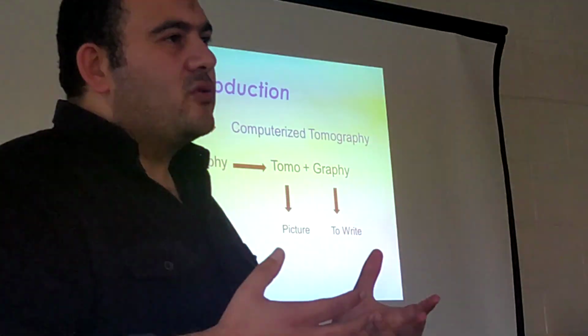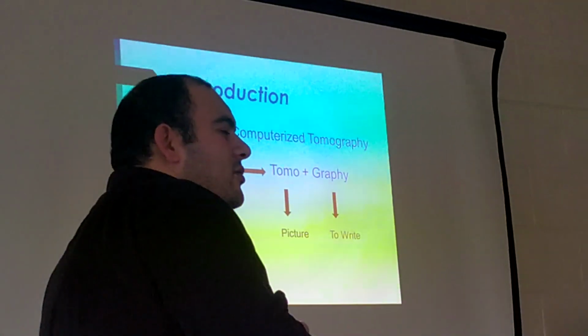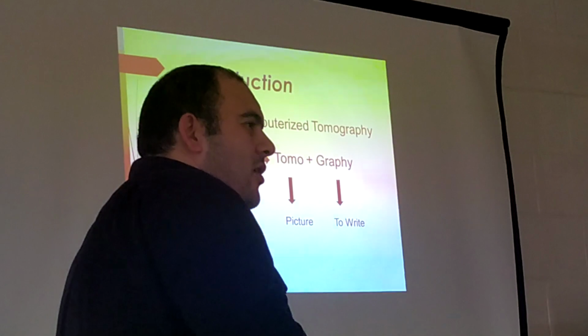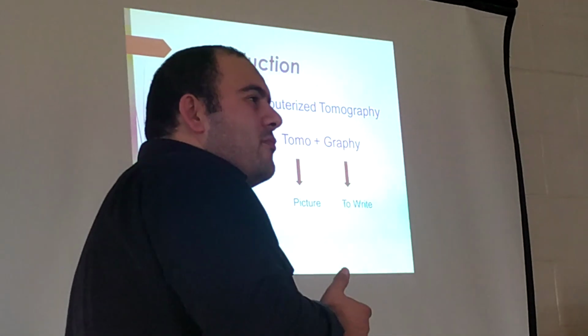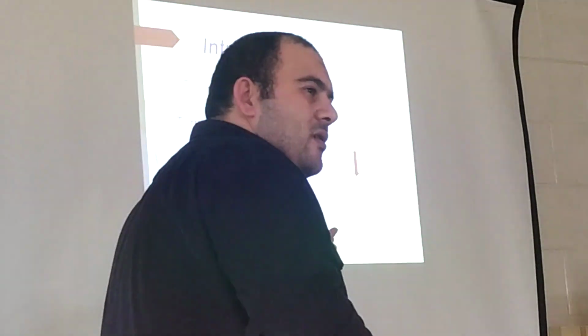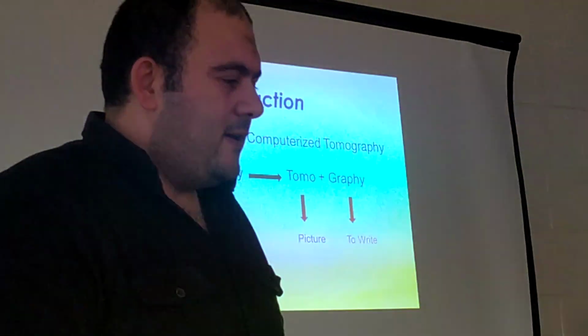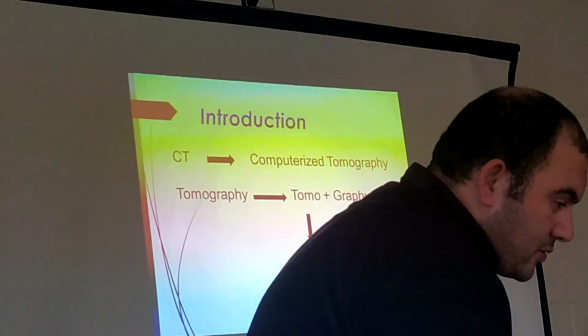Computerized means we are using a computer. This term tomography, you will find in positron emission tomography for PET scan, or single photon emission computed tomography, SPECT scan, which uses a gamma camera. You will find this term in different modalities, or computed radiography. So tomography is a Latin word.